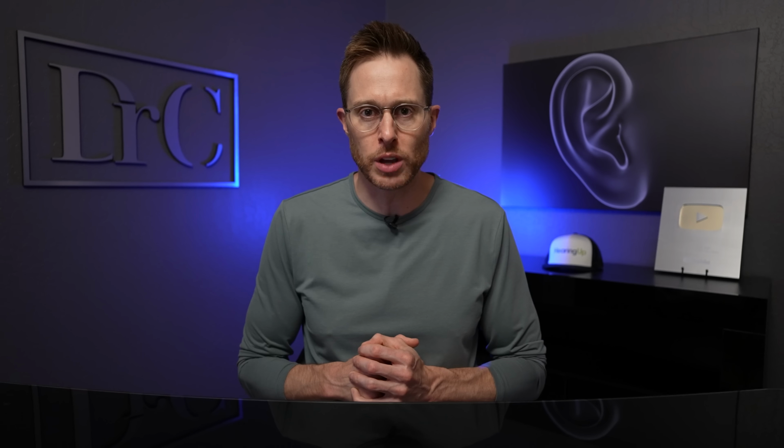The only people I really expect this size to be an issue with are people who have extremely narrow space behind their ears, or if they have really stiff cartilage that if you push on it at all, it creates a lot of soreness. Now let me go ahead and give you some size comparisons of the Sphere Infinio hearing aids with some other models from the previous generation.